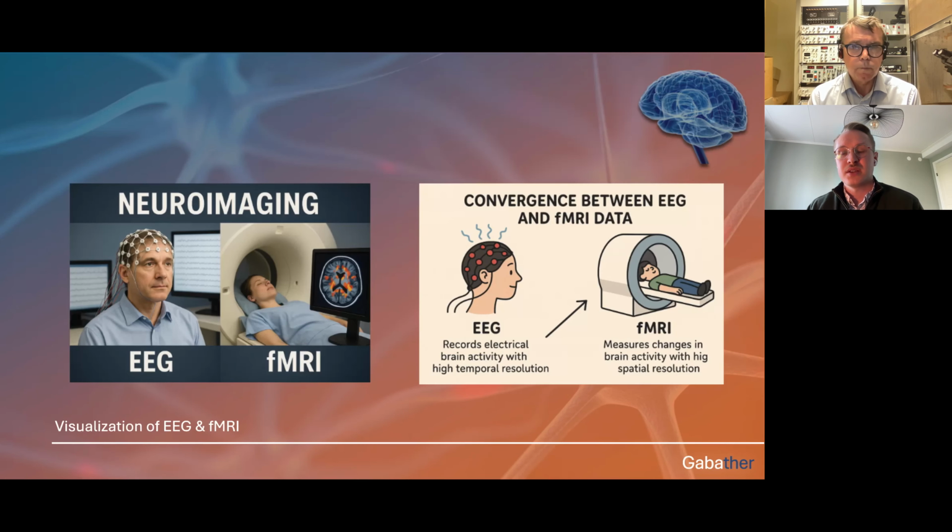It's interesting also, as we've discussed in conversation before, looking at the time frame. In EEG it's so short, but then you can look over a bigger time span in the fMRI and see how the brain activity goes over time in a totally different way. Exactly, so in that sense I always said that they are complementary. One is fast but not so precise with the area. The other one is very precise with the area but slower. So in that sense, it makes sense that they're combined.